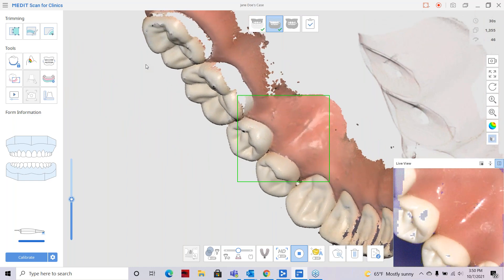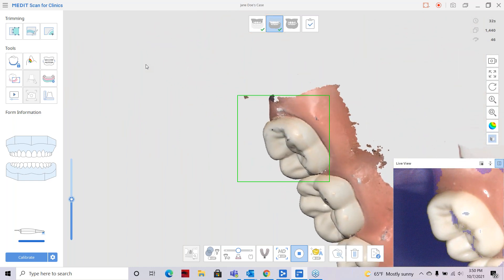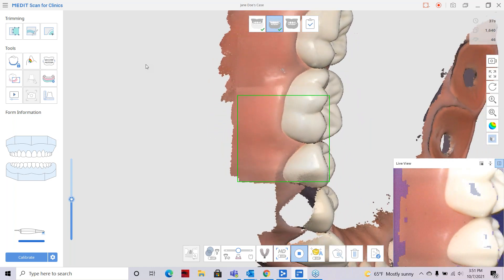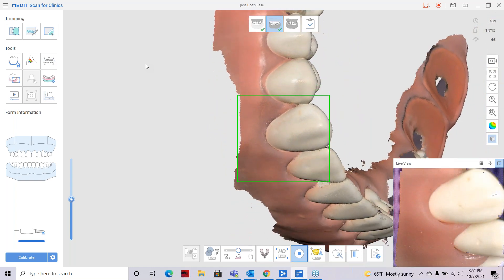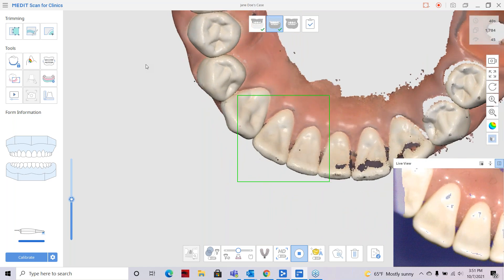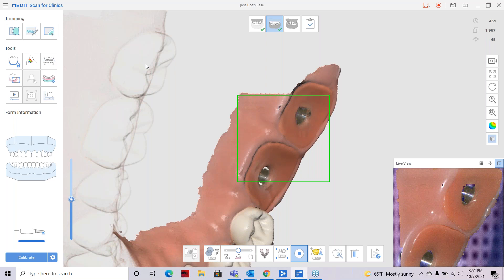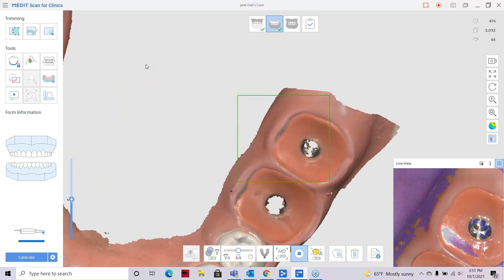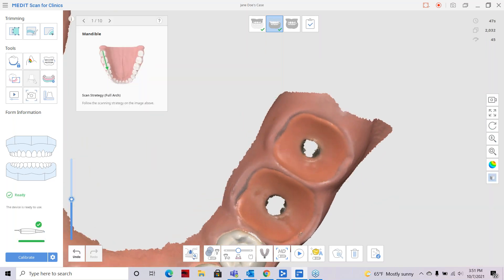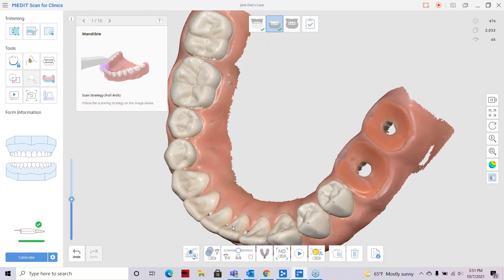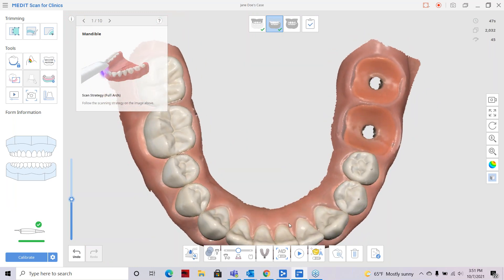For the sake of the webinar we're going to rush through this a little bit. I'll go back on the lingual and then pull out on the buccal. I like to pull the scanner out of the cheek on the buccal because it allows me to have no cheek resistance. Sometimes when you push the scanner into the mouth on the buccal surface you end up with a little cheek resistance. So not our best scan in the world, but let's check for any interproximal spaces we want to pick up.